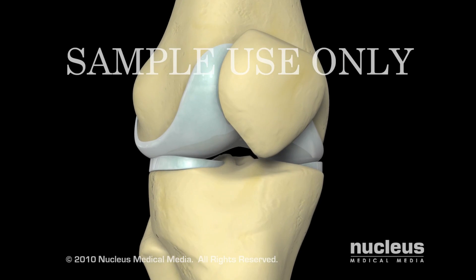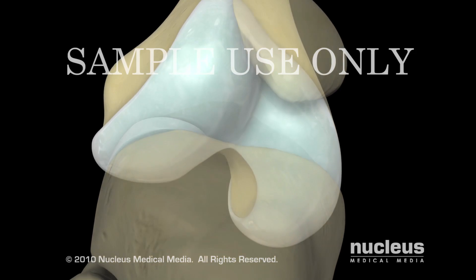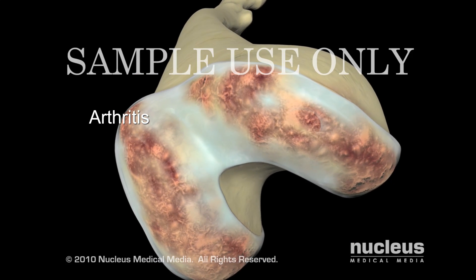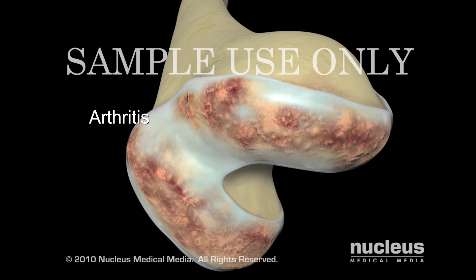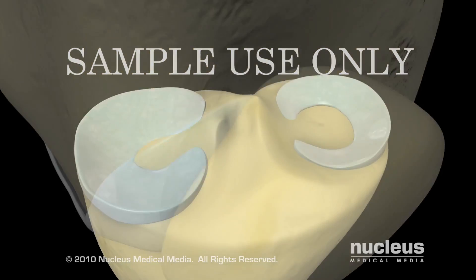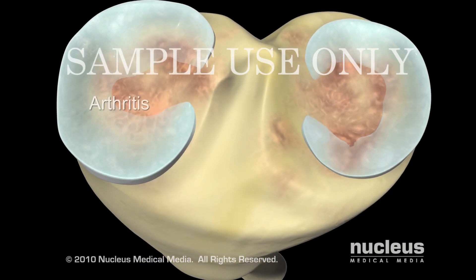Total knee replacement surgery is a procedure in which a painful or poorly functioning knee is replaced with artificial components. If your physician has recommended a total knee replacement, it is probably because your knee is severely damaged by arthritis or injury.